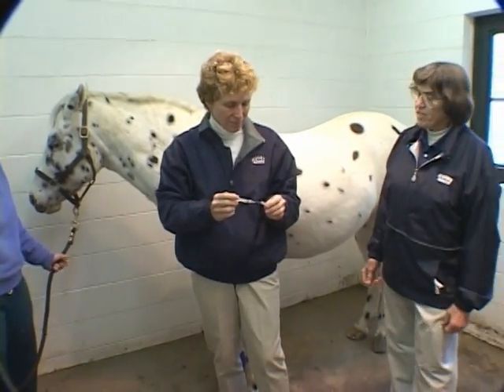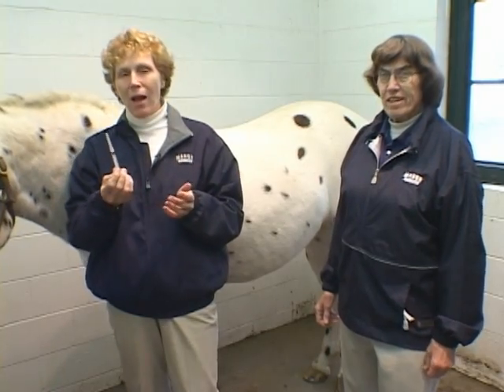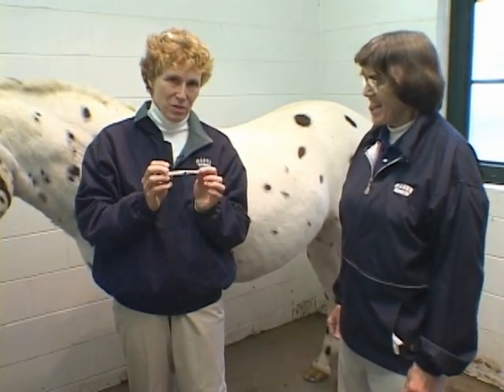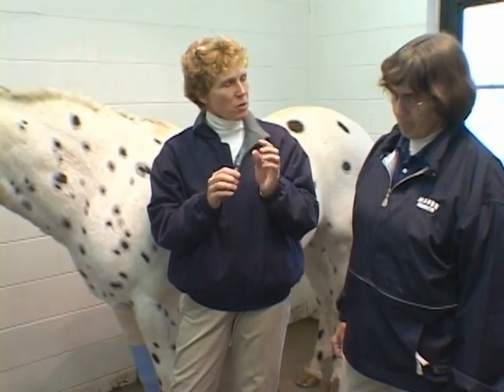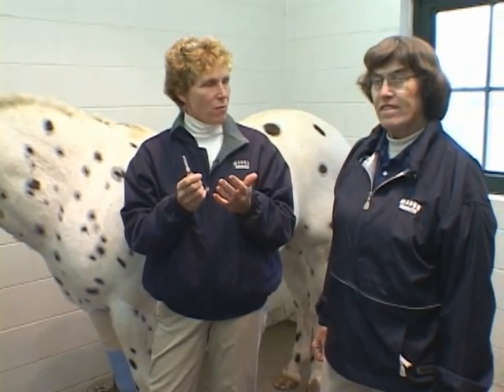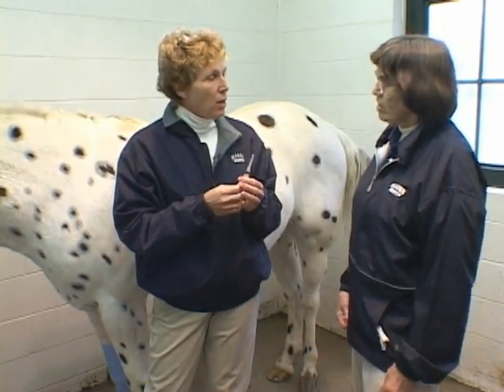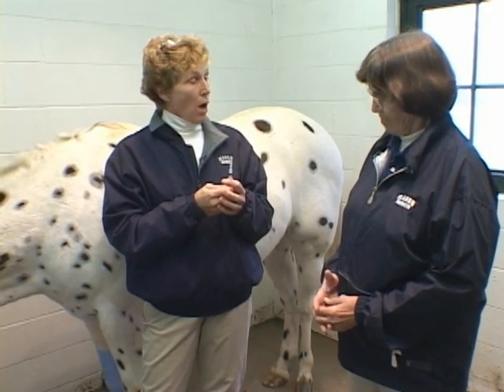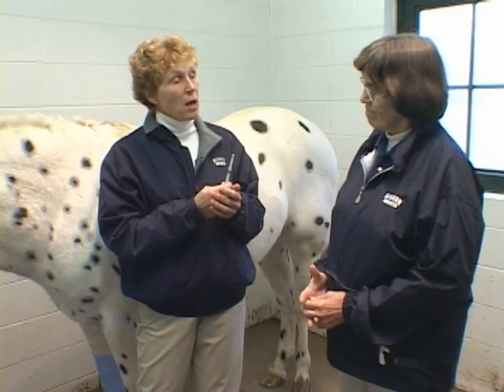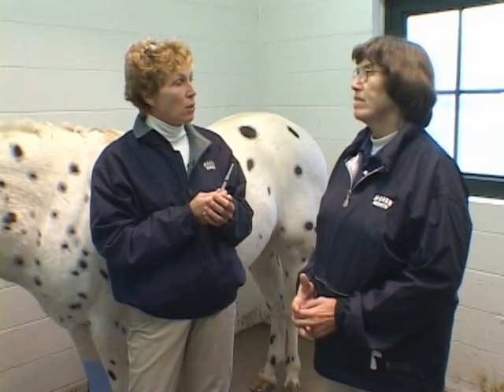What size needles do you like for your IM injections — gauge and length? Well, I'm an old softie — I like to use skinny needles. I'll use a 20, even a 22 gauge. Most vaccines are really not very viscous; you can push them through a very skinny needle. If it came down to using something thicker, like procaine penicillin, then I'd be inclined to use a fatter needle, like a 19 gauge. Generally, with little horses or most vaccinations I'm going to use a one-inch needle. With larger volume or more viscous products, or a bigger horse, I'd use a one-and-a-half-inch needle. I don't know that I ever use anything longer than a one-and-a-half-inch in practice.